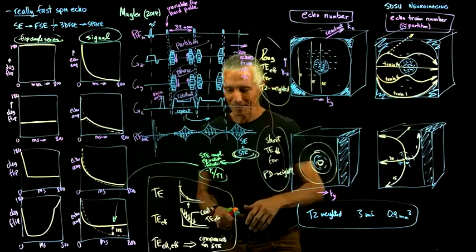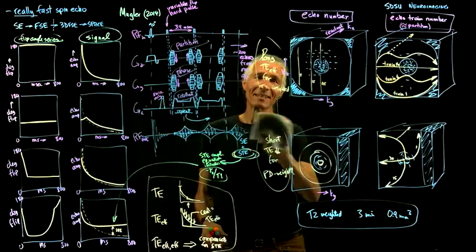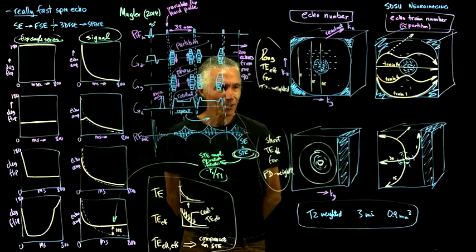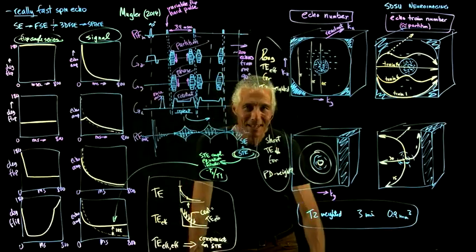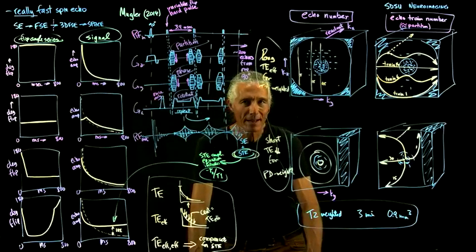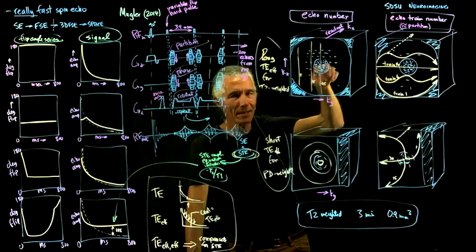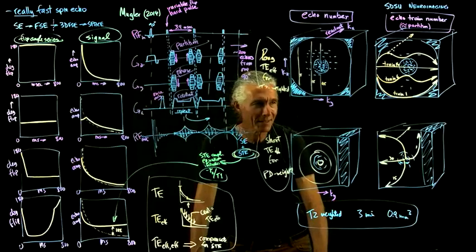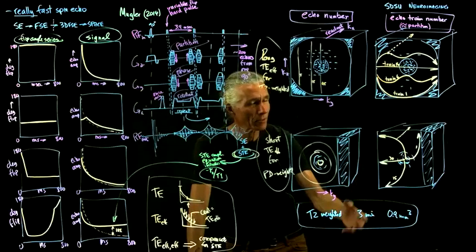Okay, so sorry I didn't leave any room in the diagram here for my face. So, any questions about really fast SpinEcho? Sort of clear? You can see approximately how these optimizations are happening. I think you could probably go even faster than this if you did some of those things I was talking about in the 8 a.m. lecture, some kind of compressed sensing, where instead of just leaving out the corners of K-space, you left out some data inside of K-space. Then you could probably get an image like this in 1 or 2 minutes. That's definitely good, because you could do all different kinds of images, or you could just do a higher resolution image.